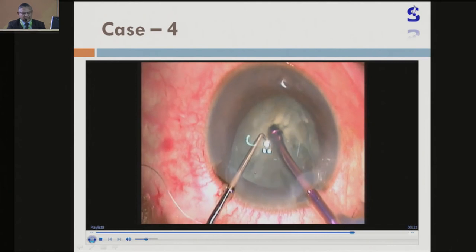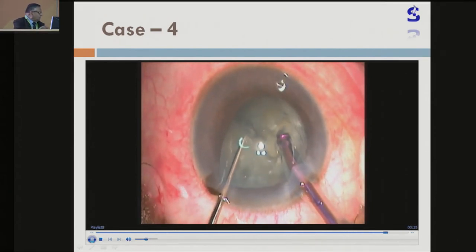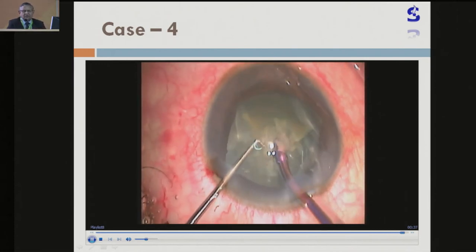You can see here the incision — the sideport was a little large, so the iris is trying to come out from that area.